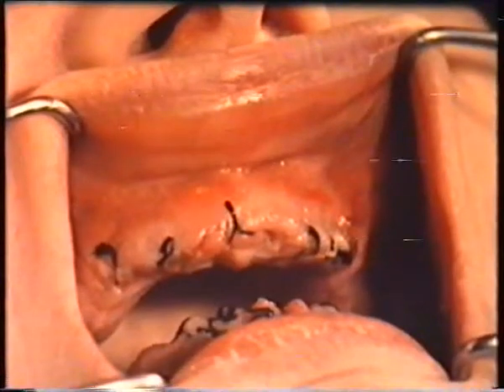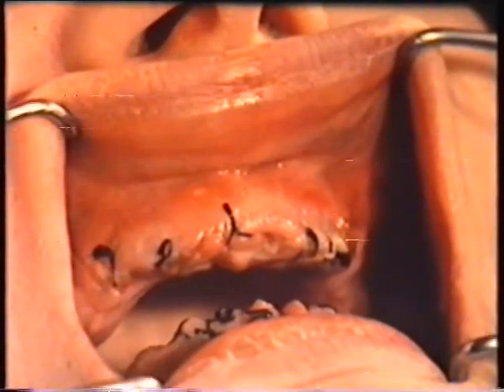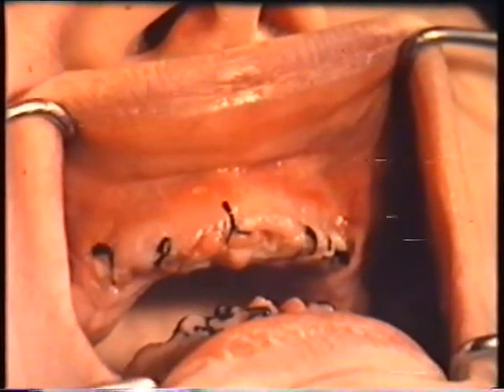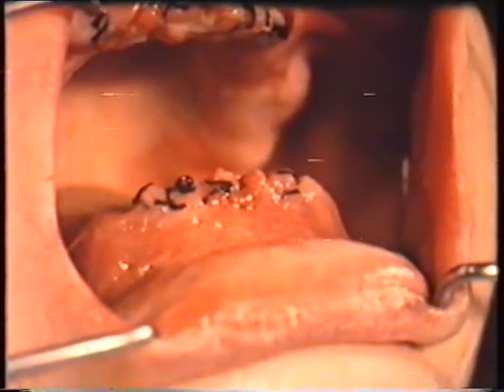Healing appears to be good in the upper jaw, but a small pressure ulceration has developed in the labial sulcus in the right incisor region. Healing in the lower jaw appears satisfactory.